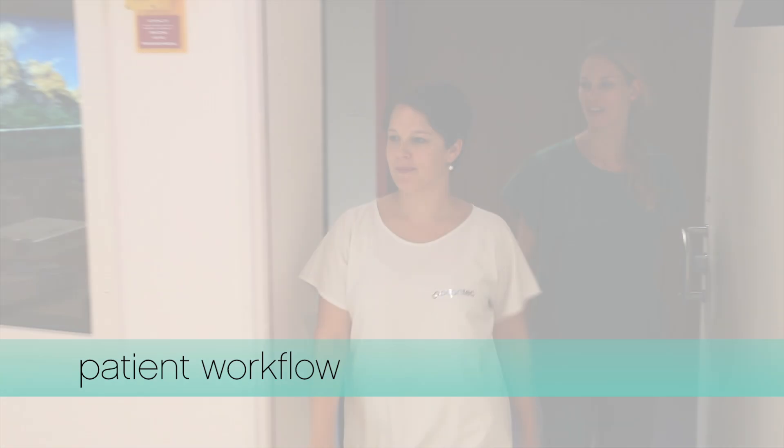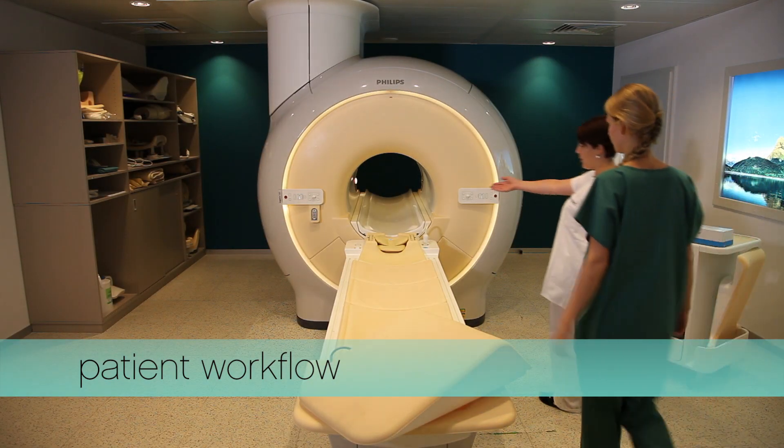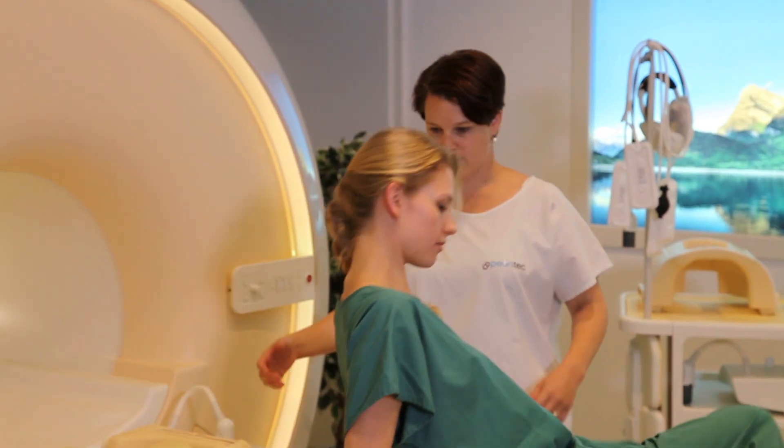This video demonstrates how easy it is to use the PearlTech multi-pad family. Welcome and start to position your patient for the scan.